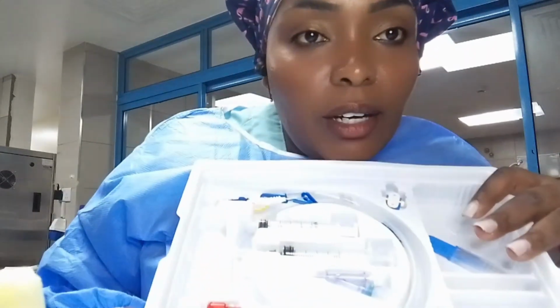This is how it looks when it's opened. This is how it looks inside, and I will show you bit by bit what is found inside my kit.